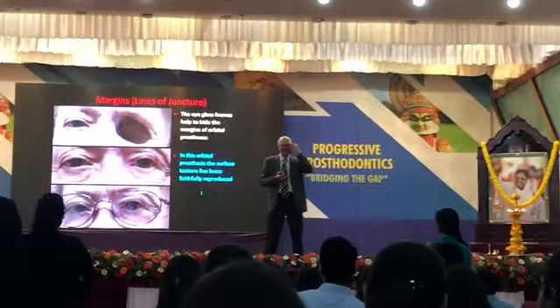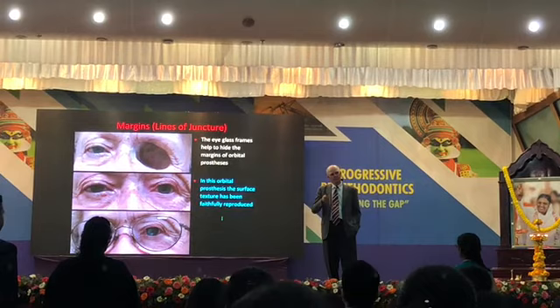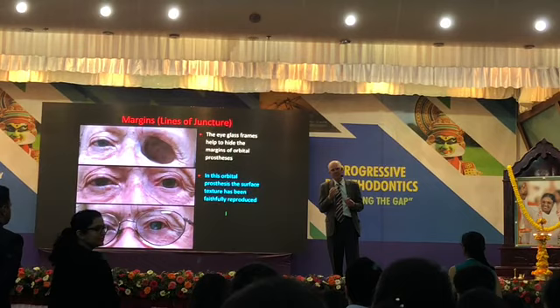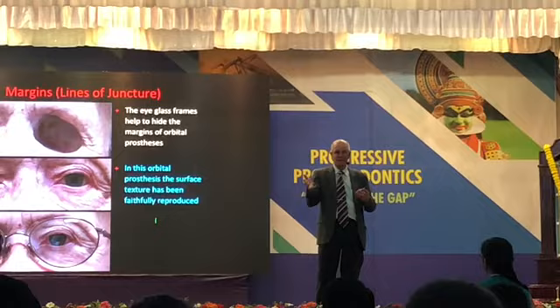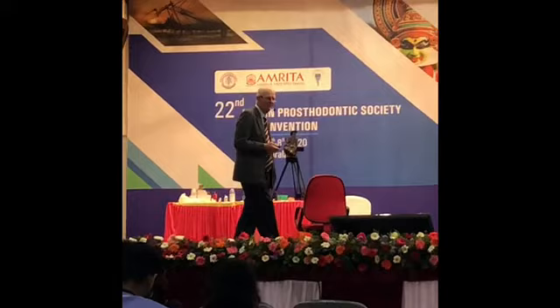They paint their eyebrows, and we would do the same thing for this. If it's a man, then you would probably send the patient to someone who can make a synthetic eyebrow. We have people in Los Angeles that work with the movie industry, and they make mustaches for us, and they make synthetic eyebrows that you can apply to the prosthesis with adhesive and then take it out and clean it and remove it as you need to. So you can do that. We've done everything, but we don't do that anymore. We used to, but not anymore.